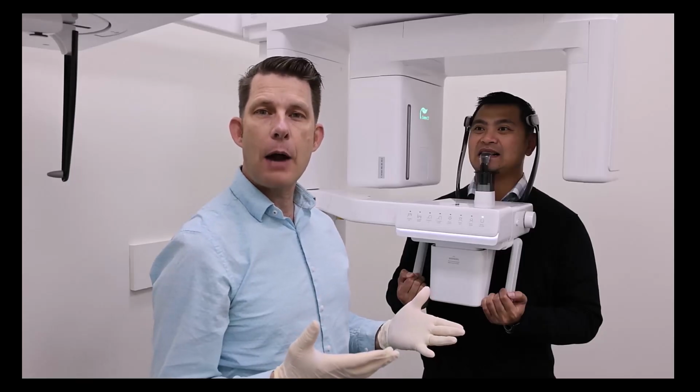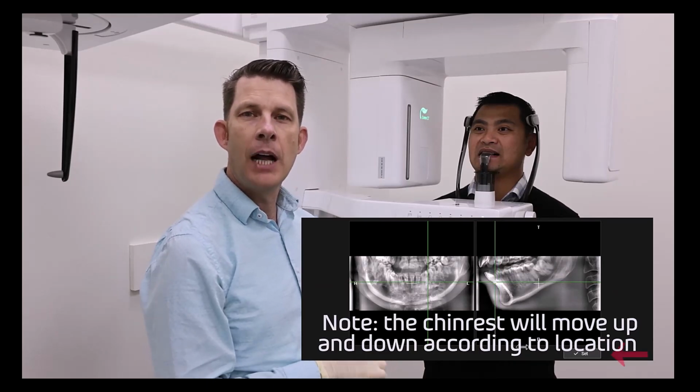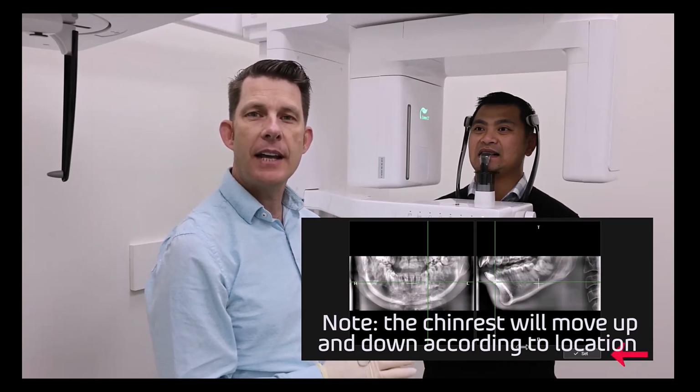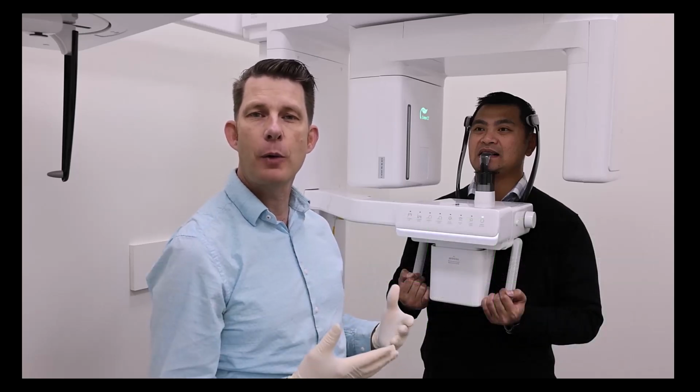We've completed our scout image, and I went over to the acquisition screen and adjusted the field of view as needed. Now we are ready to take the CBCT of the designated tooth. I'm going to step out of the room, and we're going to complete the scan.